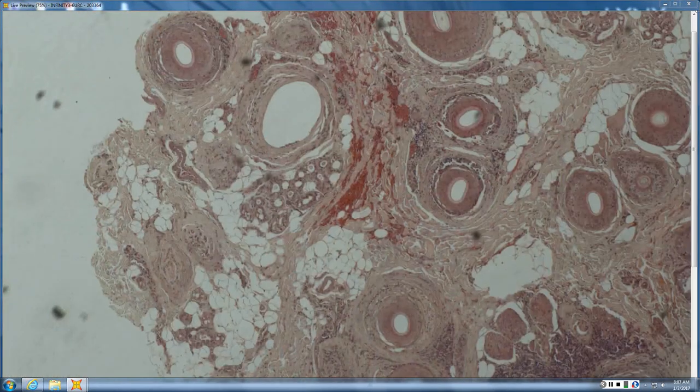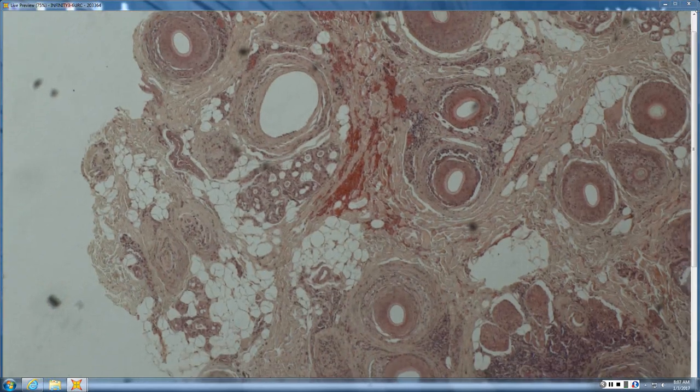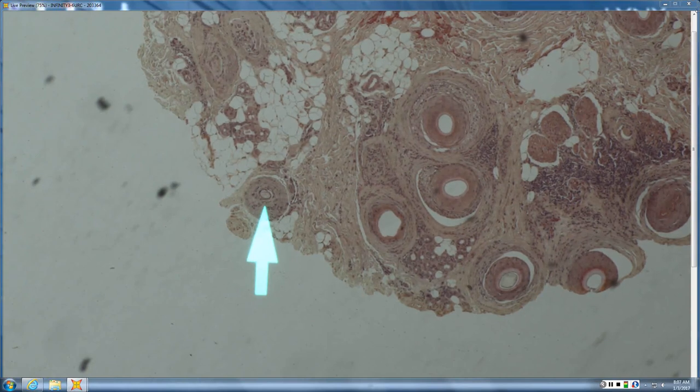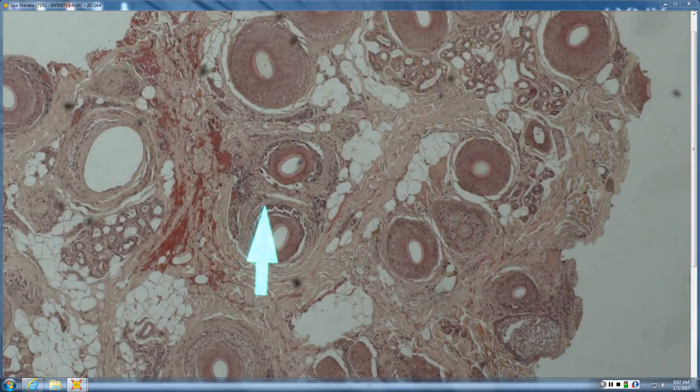Okay. And you have a naked hair shaft. Let's get it into the field for those online. Naked hair shaft there with a little granuloma around it sitting in a fibrous tract remnant. So it's definitely a destructive alopecia, naked hair shafts, right? Mm-hmm. So naked hair shaft, destructive alopecia, perifollicular mucinous fibrosis goes with that.